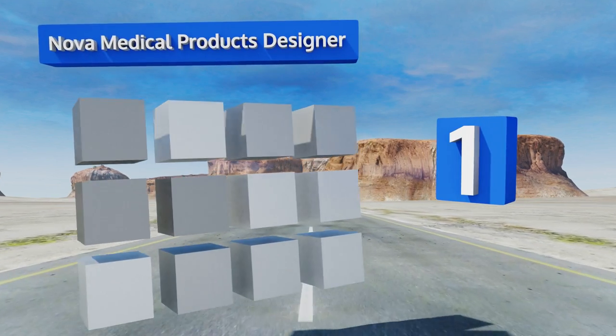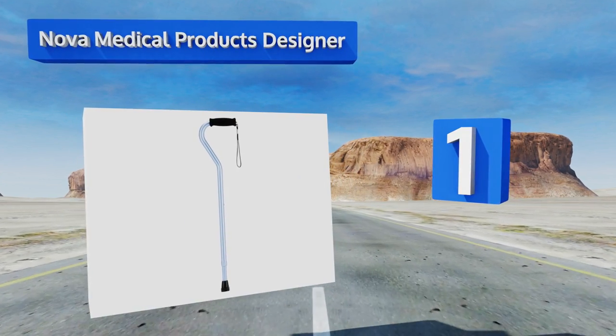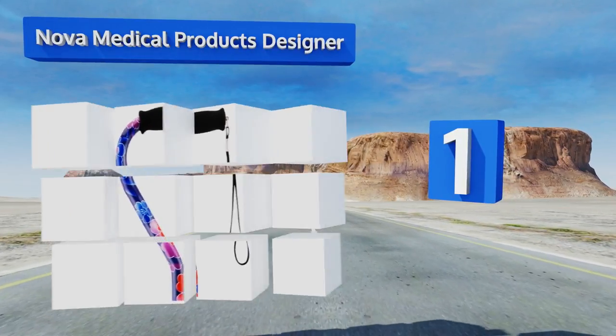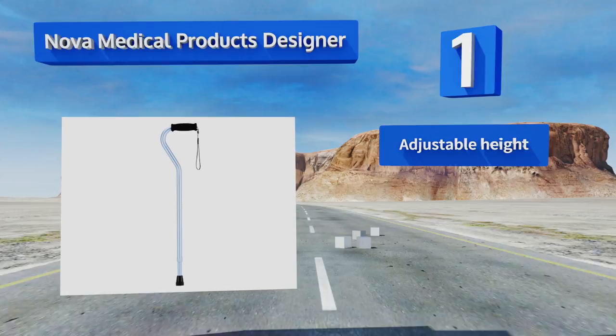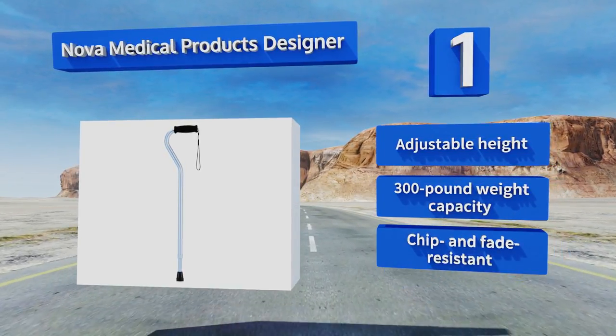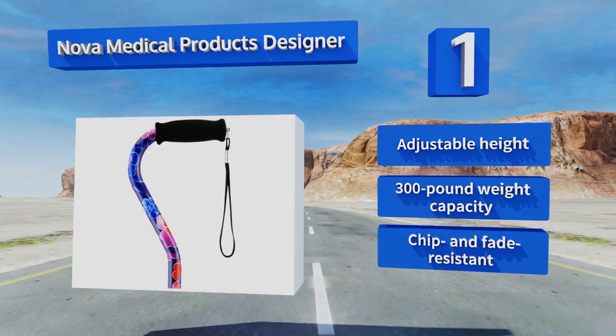Coming in at number one on our list, if you have a hard time accessorizing, the Nova Medical Products Designer comes in over 30 color and pattern finishes, each of which is inexpensive enough that you can stock up on more than one without breaking the bank. It boasts an adjustable height and a 300-pound weight capacity, and it's chip and fade resistant.